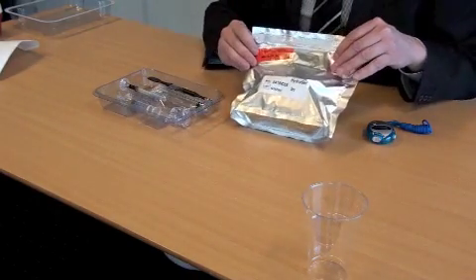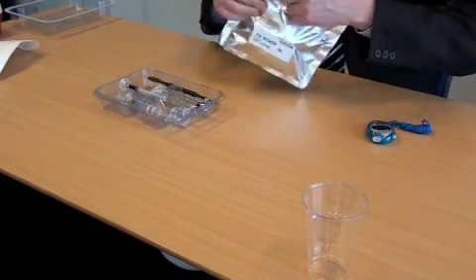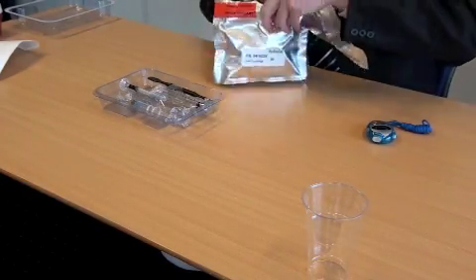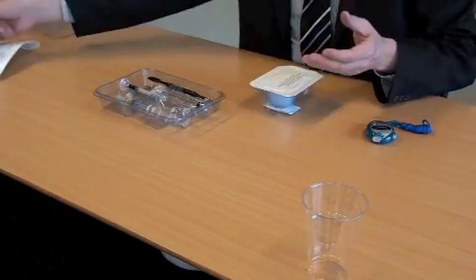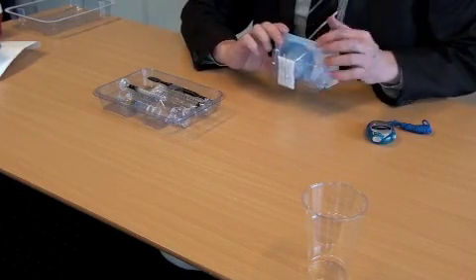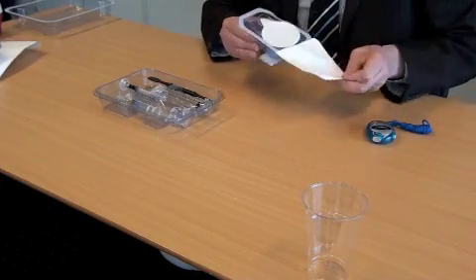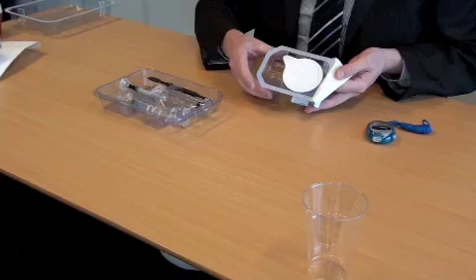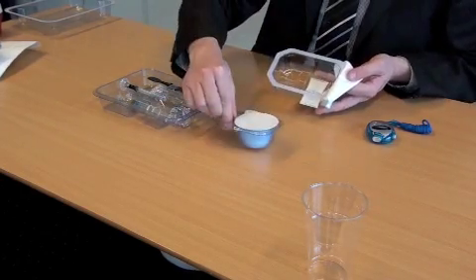So looking at the pouch, in the pouch you will find the powder. The bowl with the powder is in a blister, so you have to open up the blister first, and then you will see what you can take into the sterile field. This.